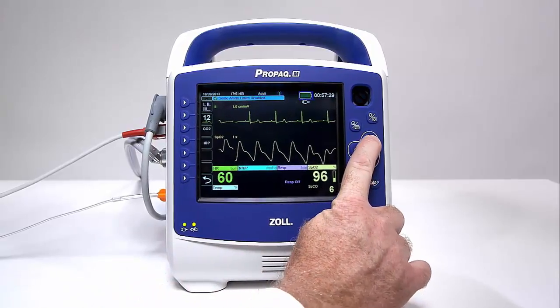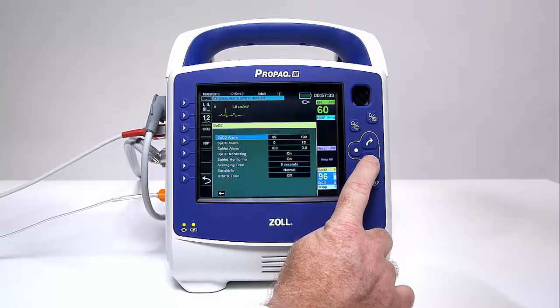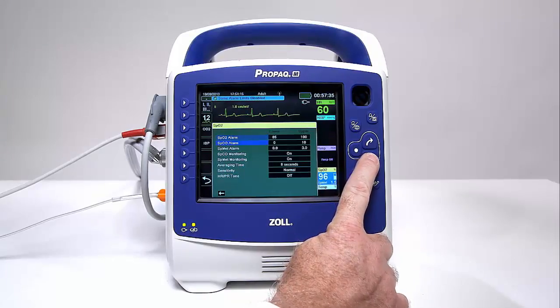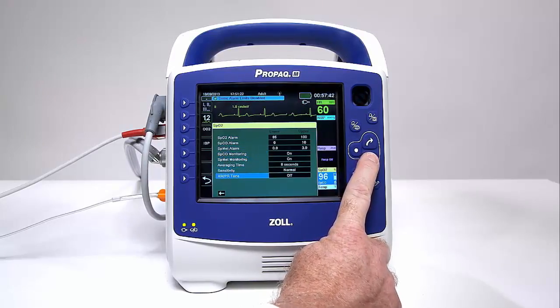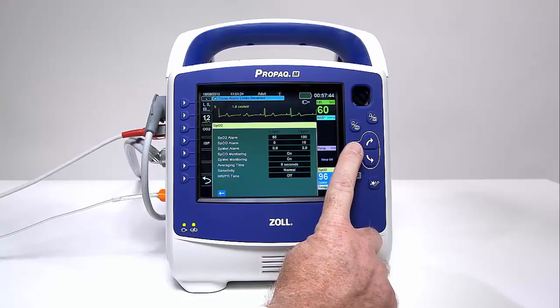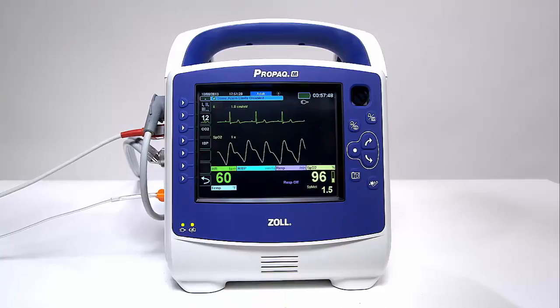This eliminates the need for users to request information, increasing ease of use. The PRO-PAC-M unit allows you to enable and disable the SpO2 alarm and to set alarm limits. Use the navigation keys to highlight and select the SpO2 numeric to view the SpO2 parameter control panel, where you can select options that optimize the use of SpO2.